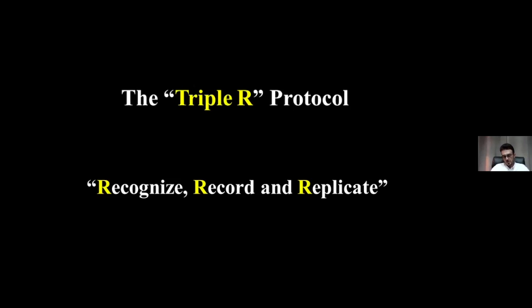It's not for producing the restoration. This is one. The second thing is in the replication. If you are going to use it chair side, it has to be with a monolithic restoration, either a zirconia restoration or a lithium disilicate restoration. You cannot apply it chair side with micro layering or layering techniques. So let's begin with the first step.